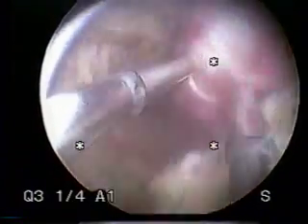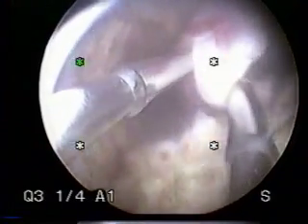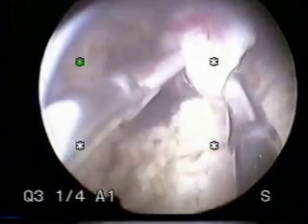You can see that an attempt to remove this fibroid takes a bit of patience — only small fragments can be removed at one time. Again, this is very safe when done properly. The tip is being cleaned and reintroduced.